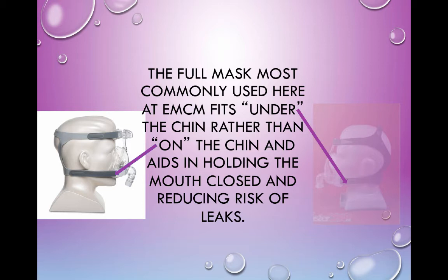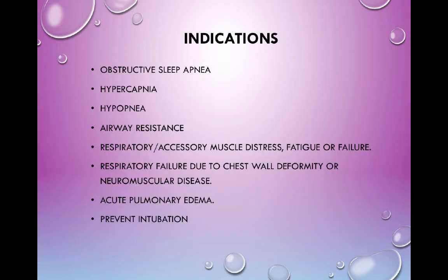And that's on purpose because we're in an acute care hospital. A lot of people are in respiratory failure, and if you have it here, they can still sometimes hang their mouth open and leak. And really, we're trying to do the best we can to support that patient so they don't get intubated. So we have this that goes across the bottom to try to hold the mouth shut. Just so you guys know, as you're positioning these things, you know where it's supposed to sit.